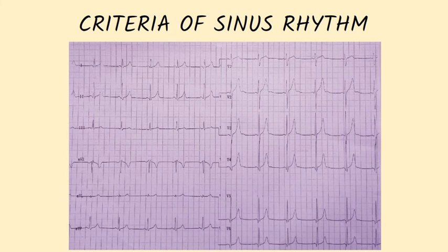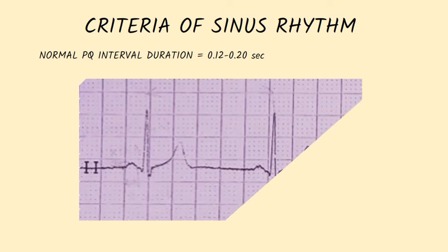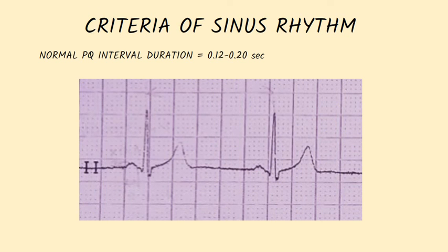Each P wave is followed by a QRS complex. Normal PQ intervals have a duration that ranges from 0.12 to 0.20 seconds. On this ECG, the duration of the PQ interval is 0.20 seconds.